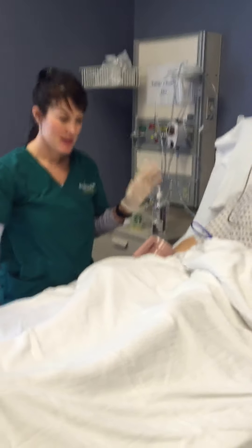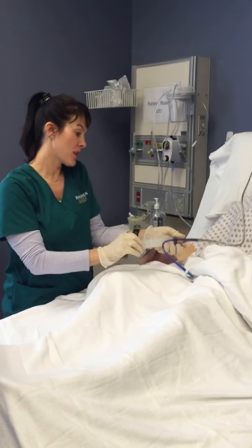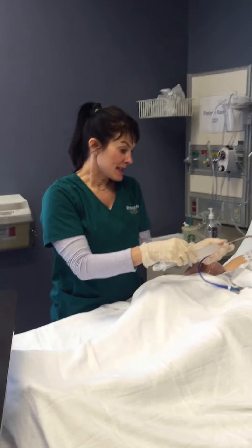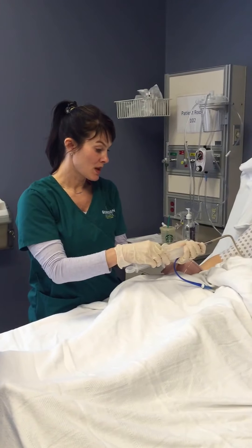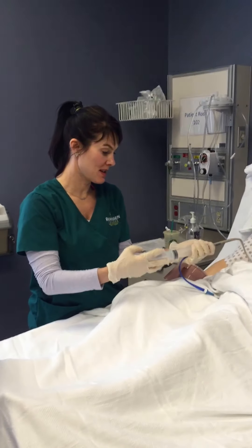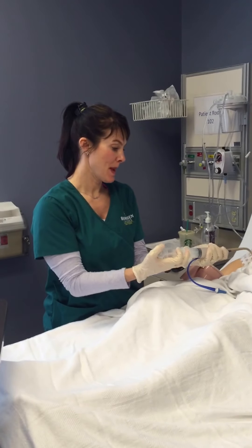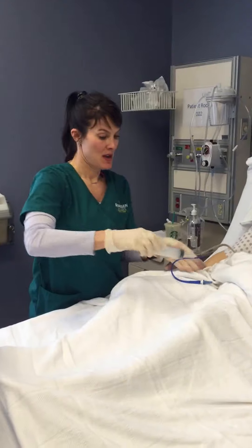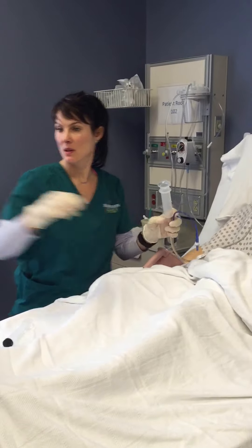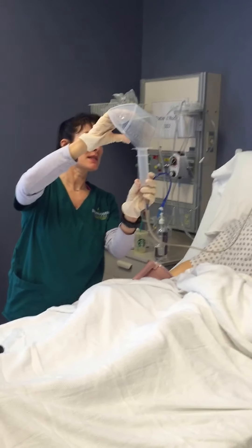I have my syringe and I'm going to withdraw gastric contents, looking for air or food. It looks like I got about 60 mLs of digested food. I'm going to put that back in. So I have 60 mLs of residual. I'm going to pull my syringe out, and I've got about 100 mLs of water — I'm going to put 60 mLs in to flush.